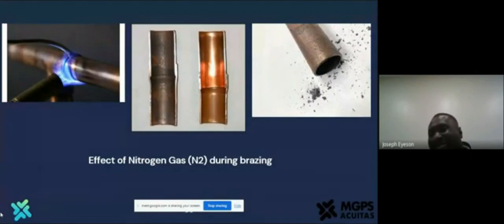But maintaining pipelines is mainly leak testing, because after the brazing works the pipelines can be there for some time, but during your preventive maintenance, you can use oil-free liquid soap or detergent to check for leakages all around. That is one of the few maintenance tasks you can do on pipelines, to be able to know if there are leakages around or in any of the joints.